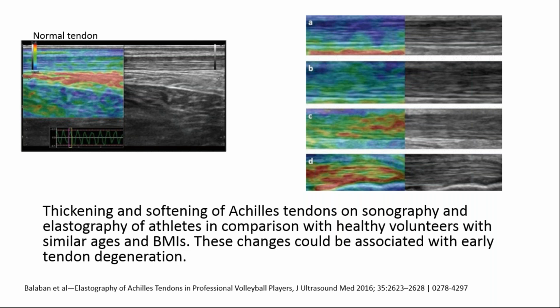That's a trend that we saw in the micromorphology of the tendon, and I think we can see the same thing here, even without that fancy Fourier analysis, which is very complicated and only engineering people can do. Now we all can do it as clinicians. If you utilize elastography, we are looking at that disorganization and also the elastic properties which are changing in the disease process. So this is a very promising area.